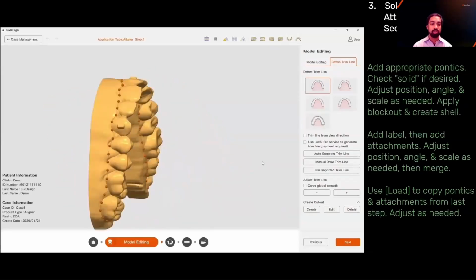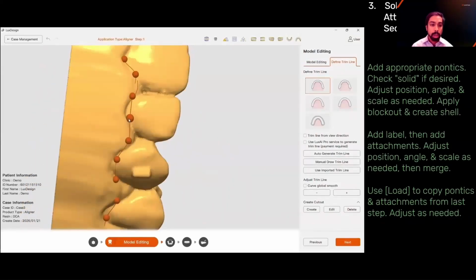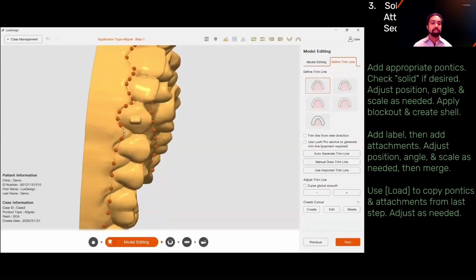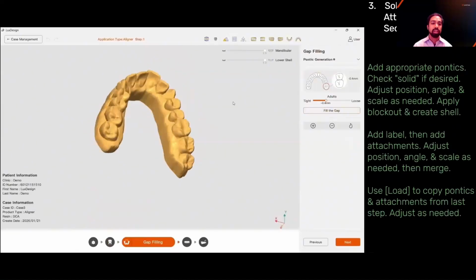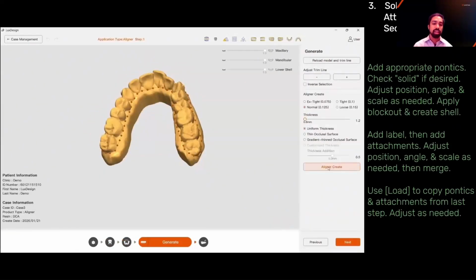And our system with DCA plus white has the right mechanical properties, the right stress retention, the right toughness and resilience to be able to pull these kinds of designs off and have the kind of retention needed to really make this work. So that's really the important takeaway here.